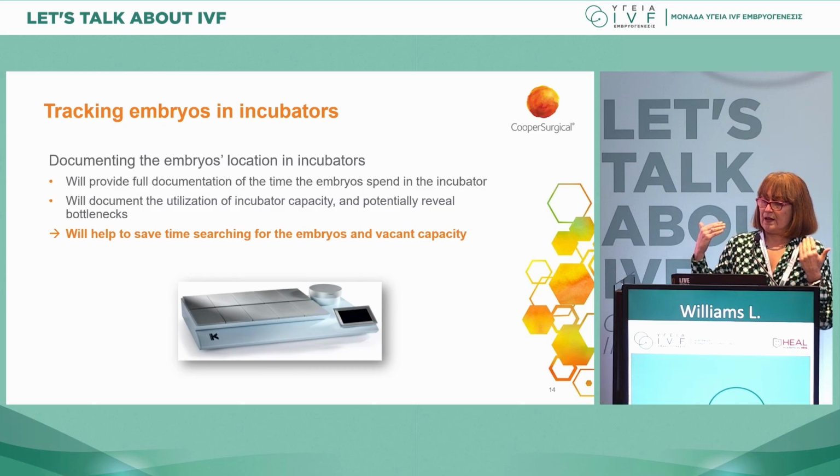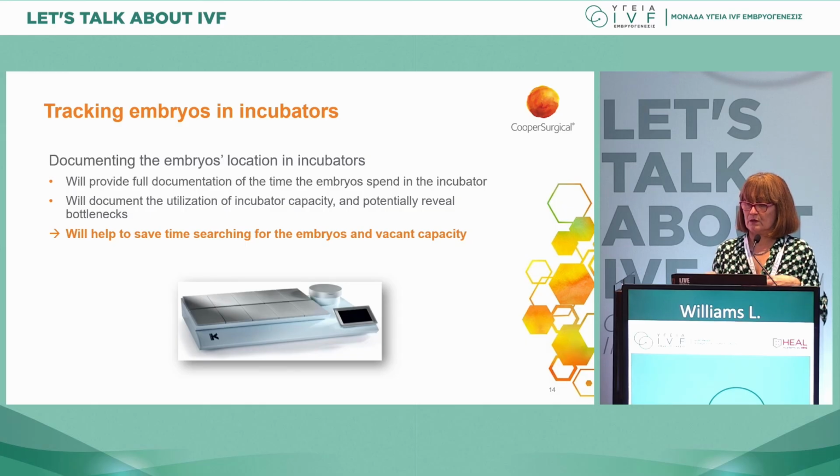You can already log when gametes and embryos are taken out of an incubator and brought into the work area, time-stamping the period within that work area. And moving forward, we're looking to increase that connectivity, providing data that can be used to plan, upscale, and refine process. So really spreading out that web, that network of data points.